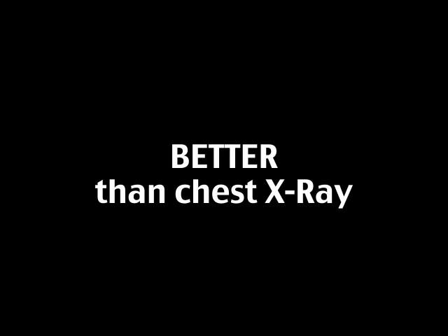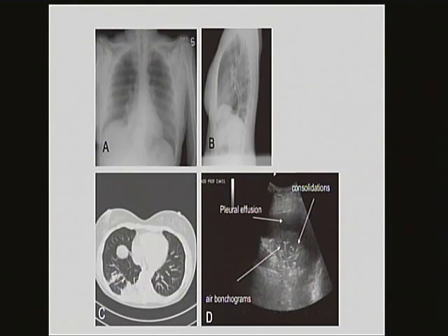Ultrasound is not just something you can do for pneumonia. It's better than chest x-ray. That's right, let me say it again. It's better than chest x-ray. It's not just that there's less radiation. It's not just that it's quicker and cheaper. It's better.